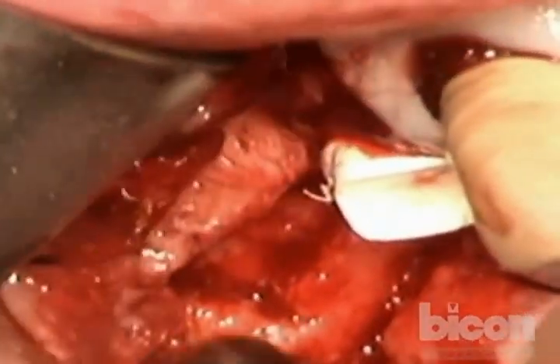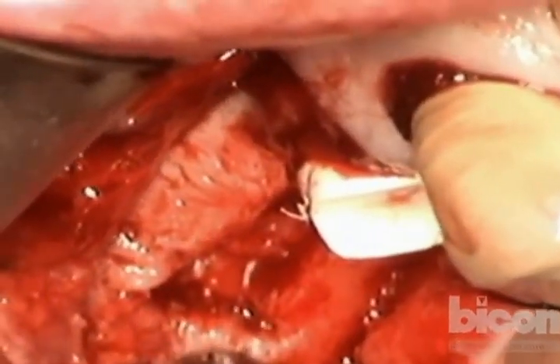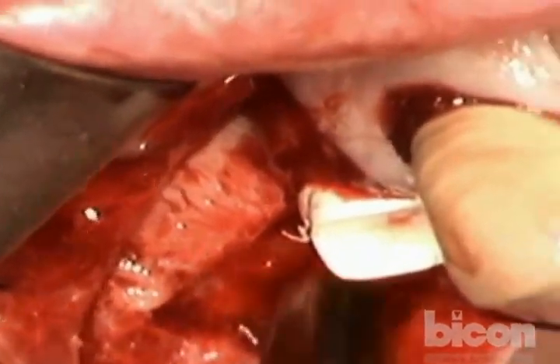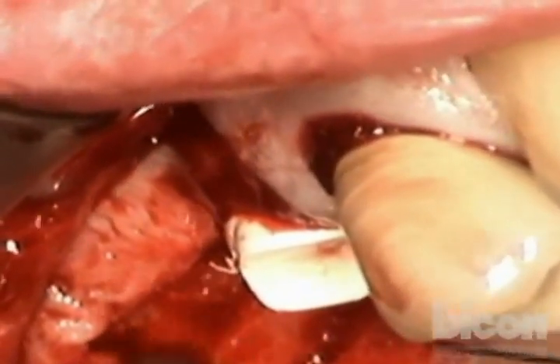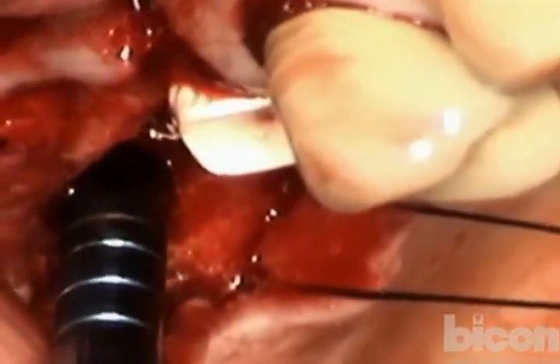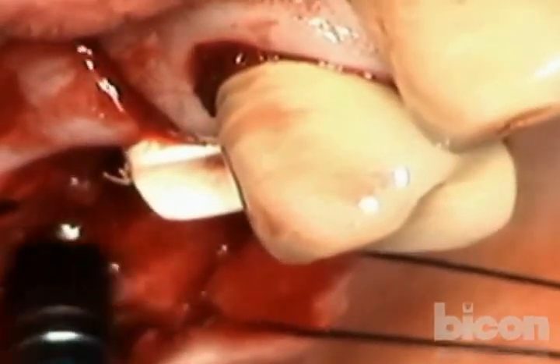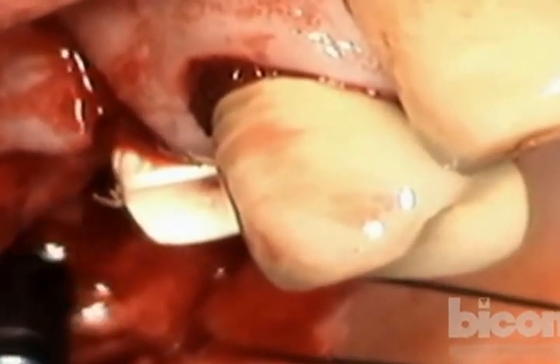The one difference in this particular case is that the distal implant is going to start in the uncut bone because it's thicker, and then we will burst into the window because this bone here is too thick to lift. This bone here is ideal, so we will start from this end, and we will finish right about there. The idea is also that the sinus lining, the mucosa of the sinus, is not the most tenacious kind of thing. It will start to tear up.